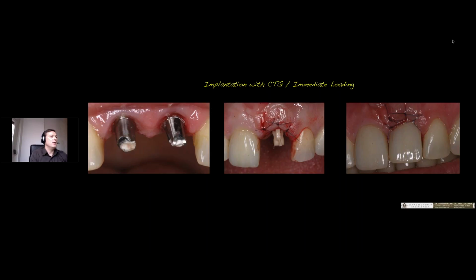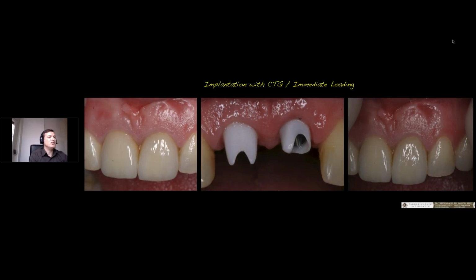So then you see, in these cases, we're changing both abutments, and in the middle of the picture you see the abutments. Inside it's titanium, outside is zirconia. These are old pictures. This case is 5 or 6 years old, because 6 years ago it was not possible to get different colors of zirconia. After this, you see some new cases. In new cases, it's no problem because it's getting better and better, and now we can have all colors of zirconia. But also in the same case, you see this white zirconia.